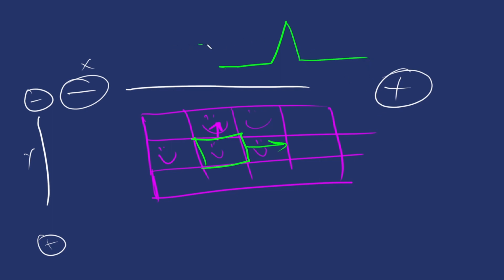Okay. So if we were to put our little markers here on our EKG, this would be like a 1, this would be a 2 here. Right, so that's a force of 2. But again, there's no change here, so even though there's a force of 2, for this one, there's nothing. And we could do the same thing the other way if we were to go back down. This one would now have the force of 2 because we're going towards the positive. And this one has a force of 0, so there's no change there.